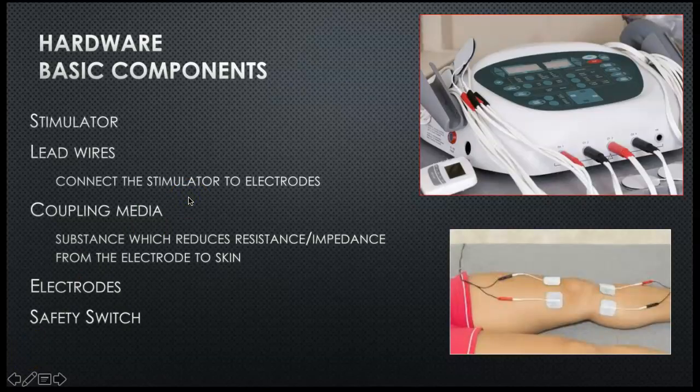Okay, we're just going to talk a little bit about the units themselves and about the hardware and some other stuff. These are the names of everything I've been talking about. When we're talking about a stimulator, you're talking about the machine. It'll be called the stimulator or the unit or the machine.